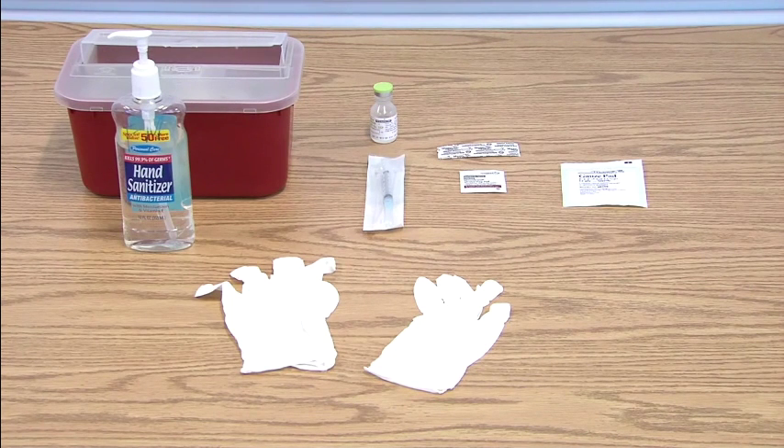Those supplies include hand sanitizer, gloves, your injection syringe, your medication, a band-aid, alcohol swab, and something to wipe up any blood if necessary.